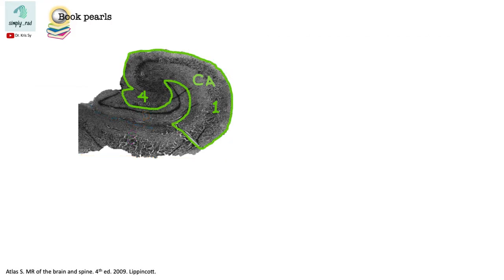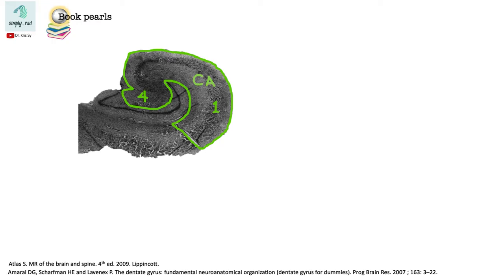Notice here that portions 1 and 4 of the Cornu Ammonis are somewhat thick. And in CA4, the darkly staining pyramidal cell layer is distinct.